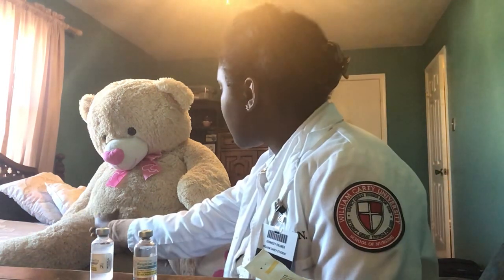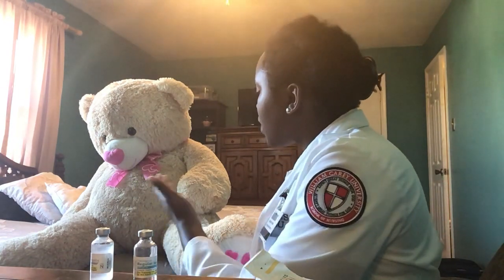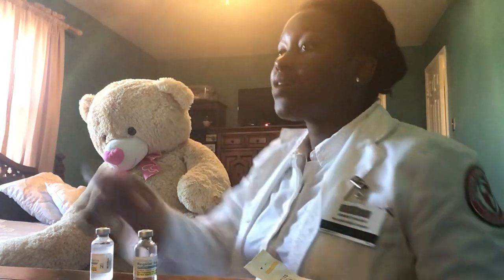Okay, the right side of your stomach? Okay, is it okay if we do it on the left side of your stomach this time? Okay, and I'm just going to assess the skin integrity. Okay, there is no impaired skin integrity.